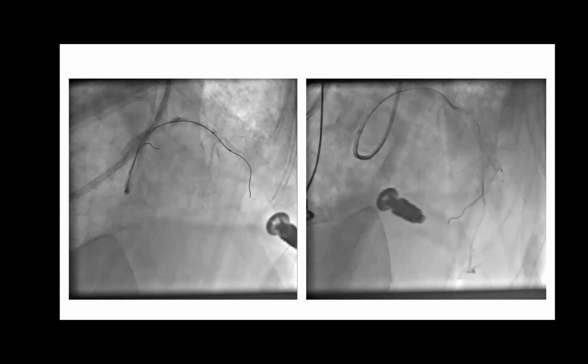in the hope that, because what was happening was the wire was in the false lumen, it was just extending the dissection, and as you can see by now, we're almost in the mid LAD, and we were still in the false lumen. So what we were trying was to get from the false lumen somehow back into the true lumen. Puncture back. The puncture back, and that's why we took the Miracle wire and used the double lumen microcatheter, and that wasn't working either.